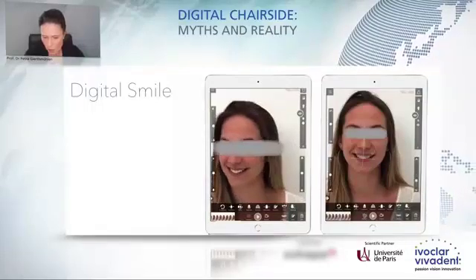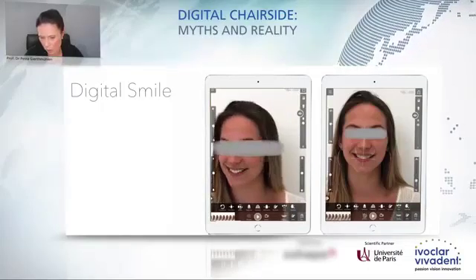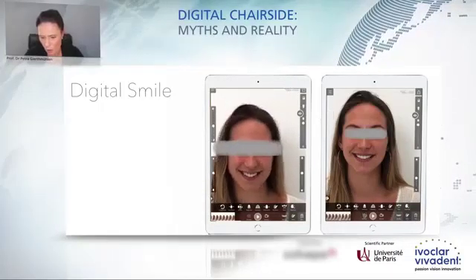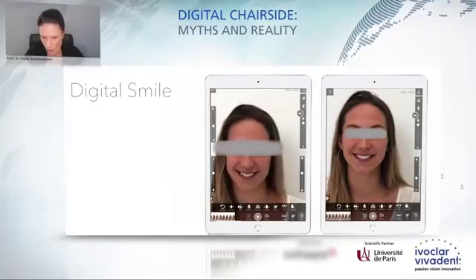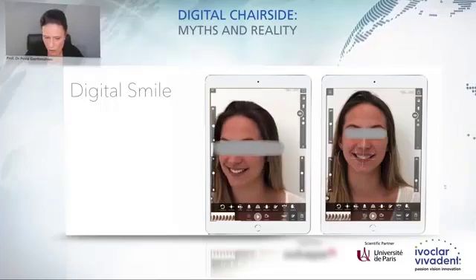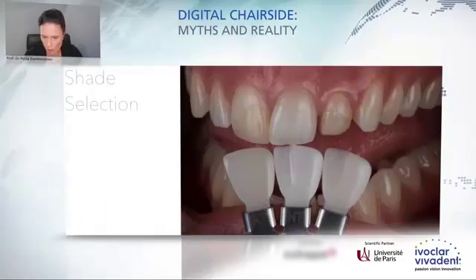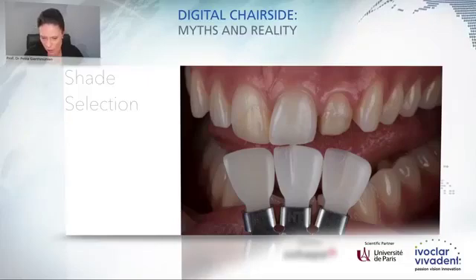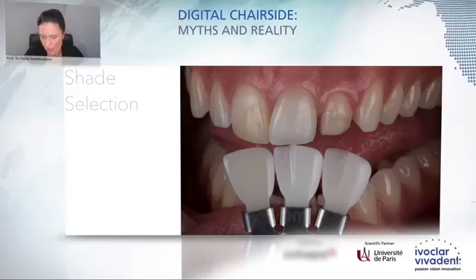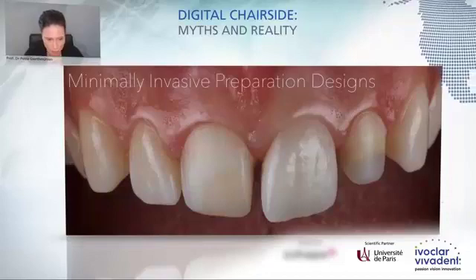And now we also love to use a digital smile design tool. It's a very nice tool to visualize the treatment outcome for our patients and also to communicate the treatment outcome with our patients. So we implement this on a daily basis when we have aesthetic cases. And one other very critical step in this whole process is the shade selection. This can really be a pitfall in this entire workflow, as it needs a lot of experience and personal justification.